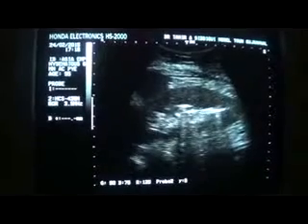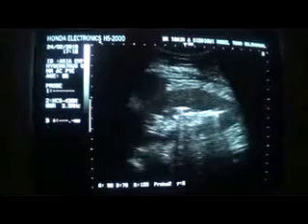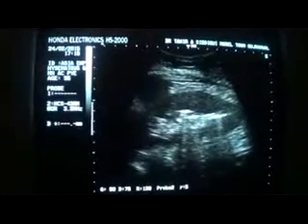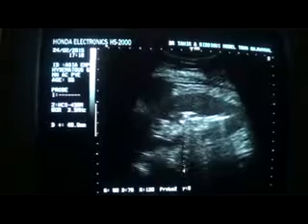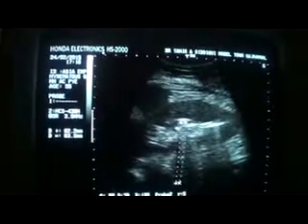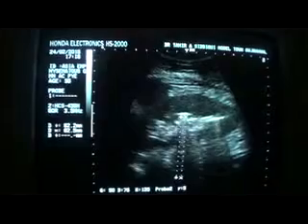Now you see this one, this echogenic, this shiny particle. These are more shiny than the calcified areas or calculi that we see in cases of nephrolithiasis, and this shiny area is giving a typical shadow, which is a reverberation artifact, and these are usually seen from air.